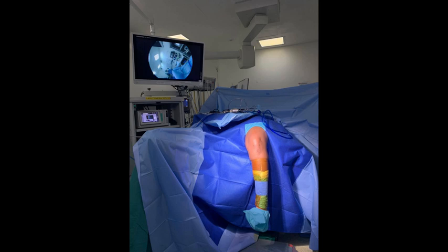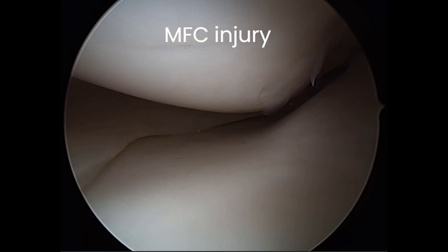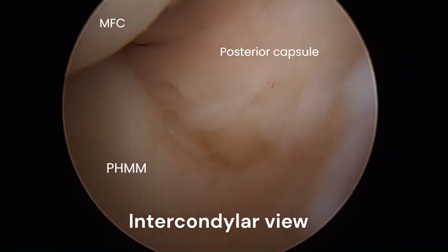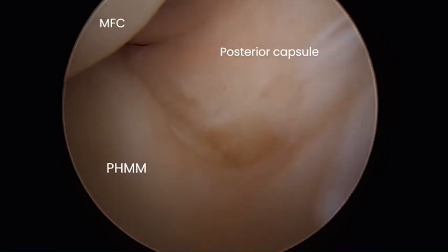The surgery is done under general anesthesia with the patient in supine position. With a thigh tourniquet, the operated leg is placed hanging off the table. Diagnostic arthroscopy revealed a cartilage damage at medial femoral condyle, which indicates a chronic medial meniscus injury. Next, the arthroscope was advanced to the posteromedial compartment through the intercondylar notch to look for the meniscocapsular tear.